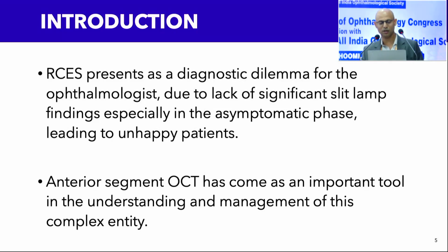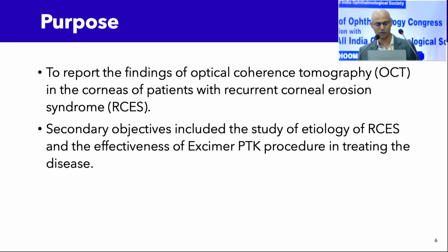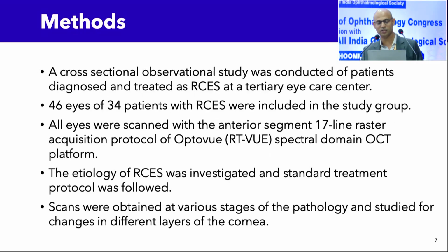And of course, when they come during the episode, then looking at them in the slit lamp, and also use of tools like the anterior segment OCT becomes important. So the purpose of this study was to report the findings of OCT in corneas with recurrent corneal erosion syndrome, and the secondary objective was to see the role of PTK in treating this condition.